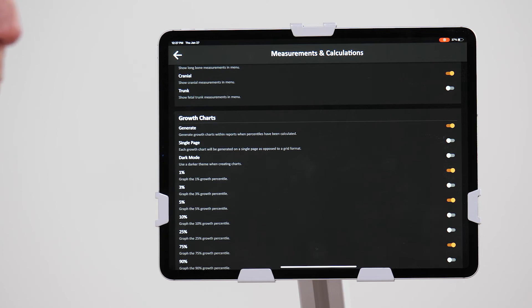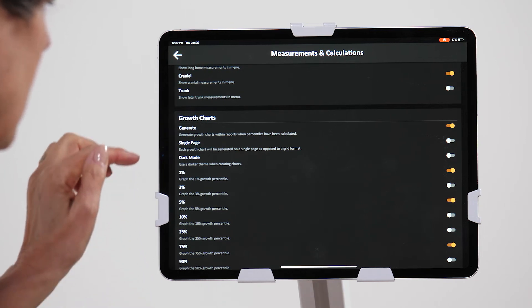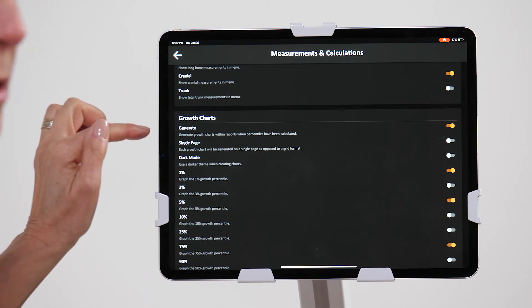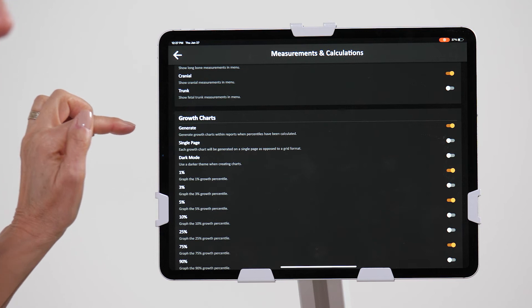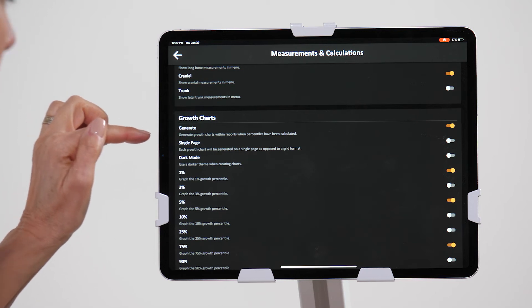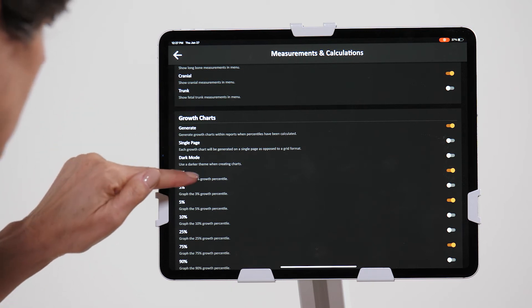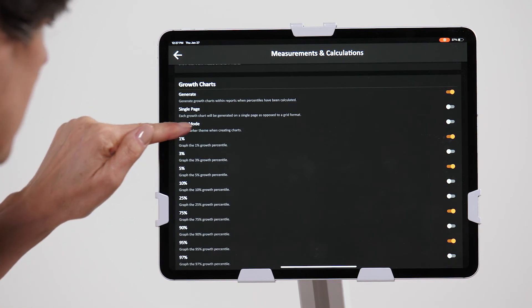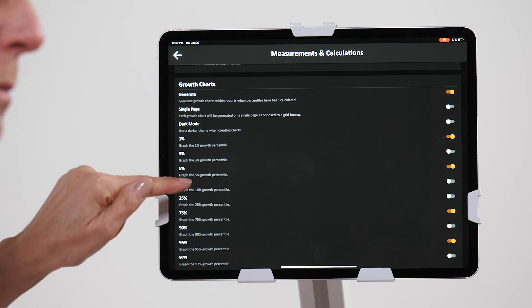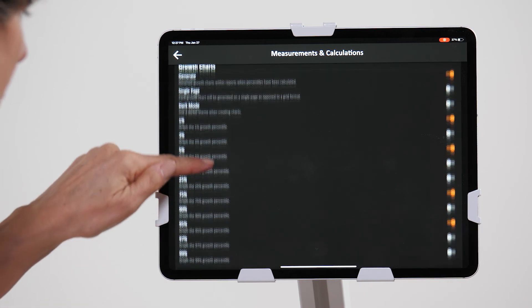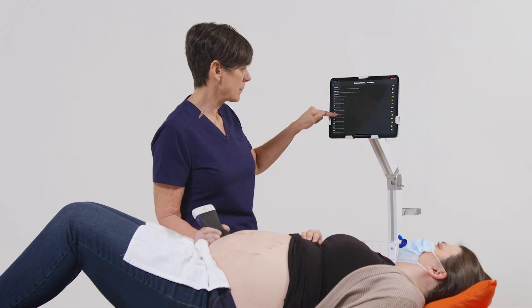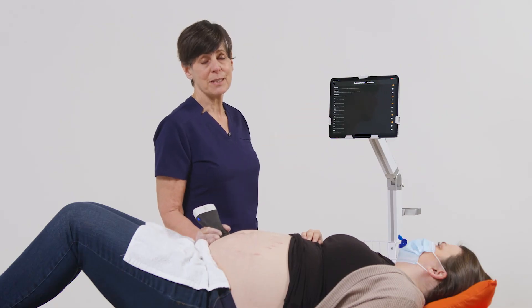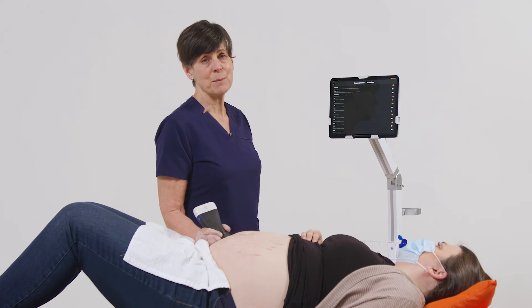We also now have growth chart capabilities. We can generate our growth charts based on due date or LMP, and we can also determine which percentiles we want displayed on the report package. As you can see, many more features with the advanced OB package.